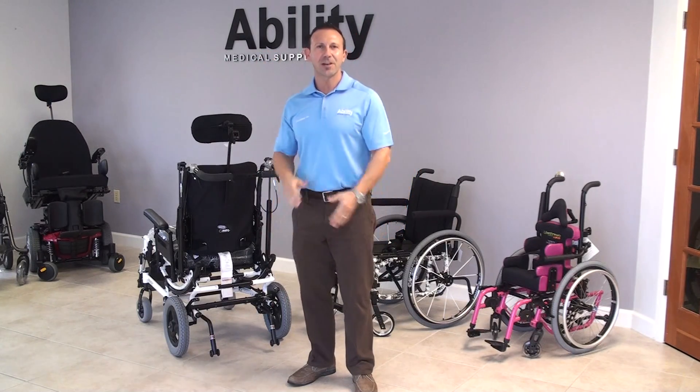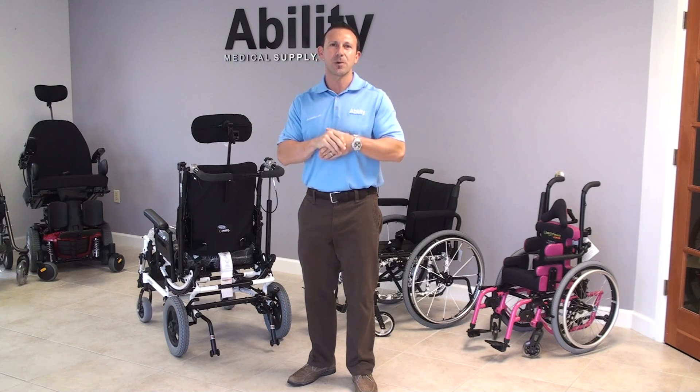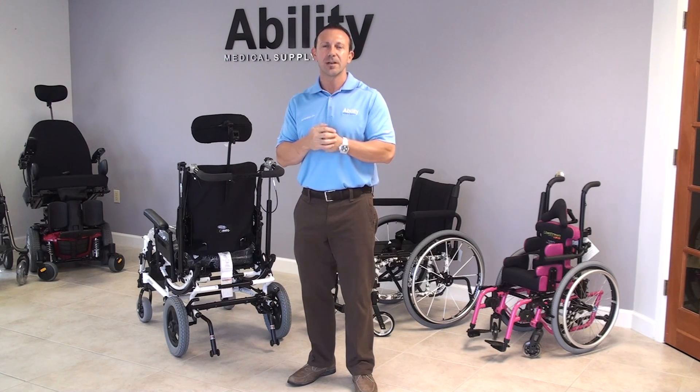Hello everybody, my name is Jed Golding. I'm with Ability Medical Supply, and we're here once again to demonstrate another piece of assistive technology.